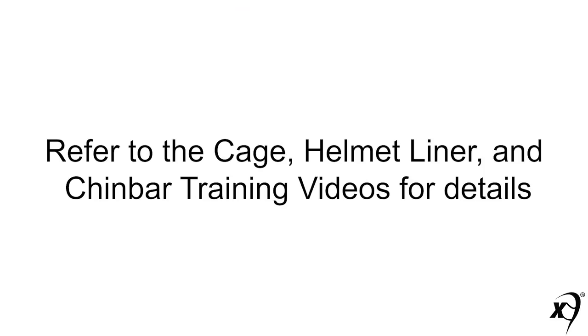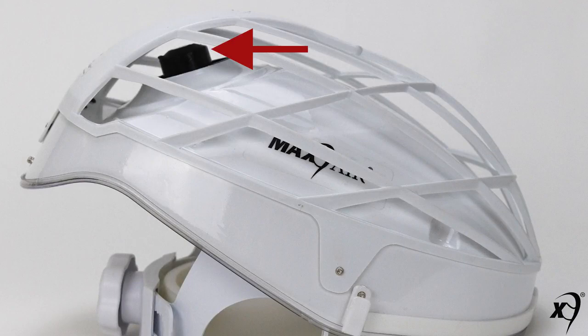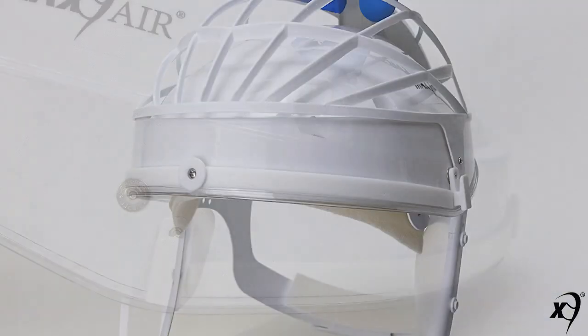Details of the cage, liner, and chin bar are covered in their separate videos. The cage provides protection for the motor blower during shipping and is left on the helmet during use as a filter frame for all hood outfits. The front, right side, and left side lens mounts are the mounts for all PR hood lenses. The side and rear top snaps are for attaching the cage to the helmet.